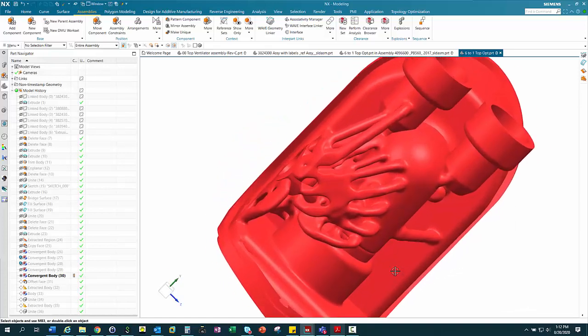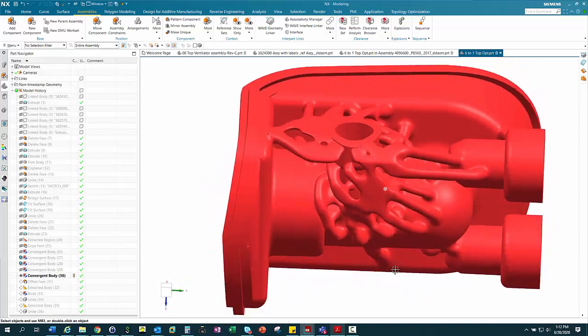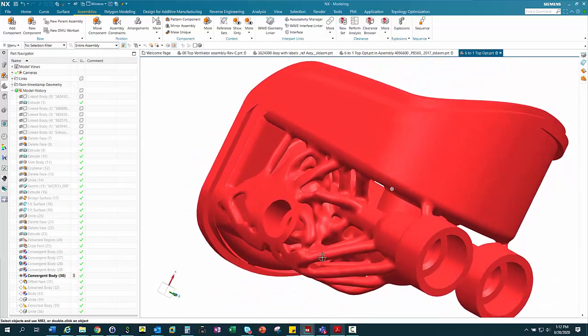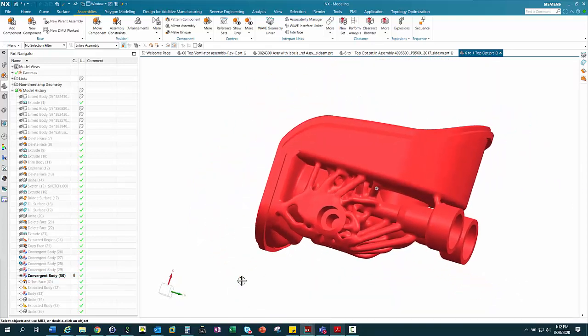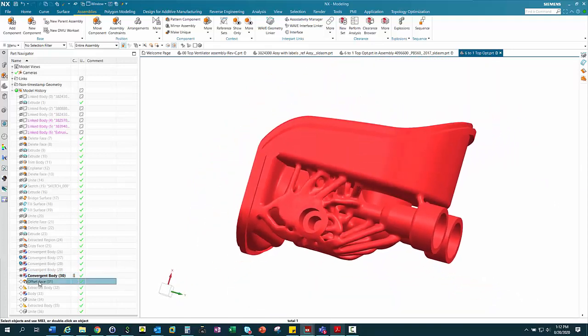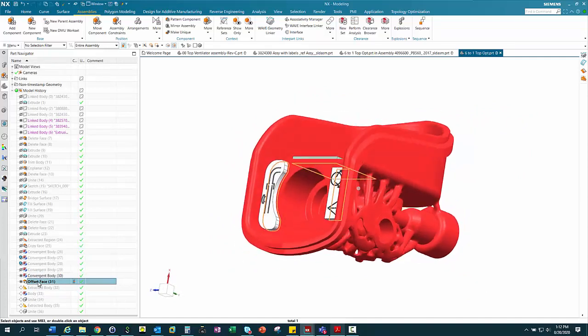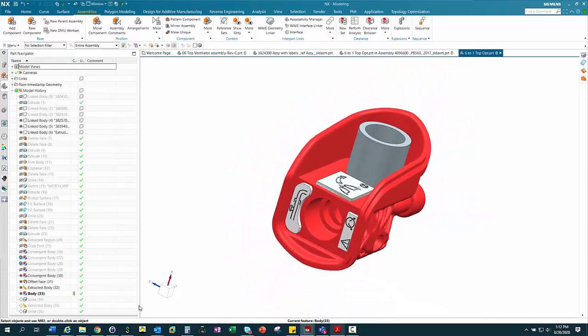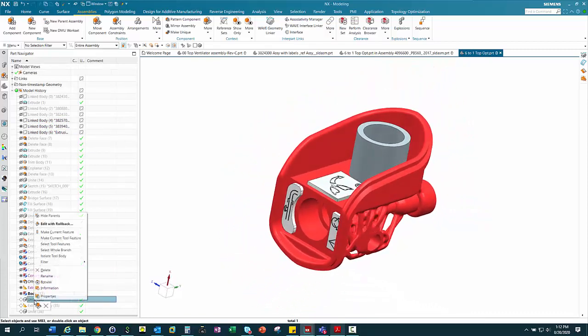This one here, you could control the spread of the material because we're printing it in powder. We don't have to worry about supports. We can get away with a skeletal structure that looks like this. And to make it even more powerful, then we could start using convergent modeling. So we could start doing things like uniting these, and we could start offsetting these shapes, adding additional features for improving the model, and we can unite things together.